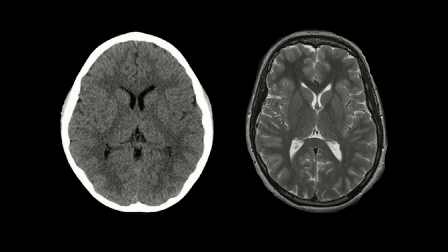Let's explore the differences between CT and MRI — I won't go into physics here. Whenever you look at a radiological image, look at the soft tissues. If the soft tissue is well defined, it's definitely an MRI. As a rule of thumb: for bone and hemorrhage, it's CT; for soft tissue, it's MRI. The image to the right is an MRI, while the other is CT.